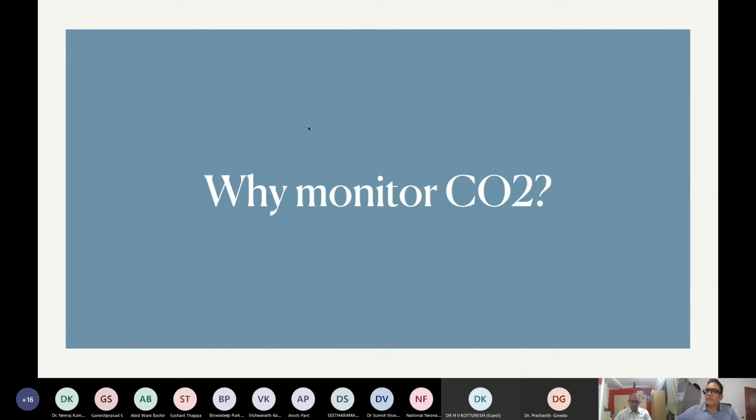Traditionally, in the past, we used transcutaneous CO2 with a basic thermal device. But the heat generated by that is very significant, and that may result in tissue burns. But the current transcutaneous monitors are very trendy and sophisticated, and there are no problems with that. I will show you that one.